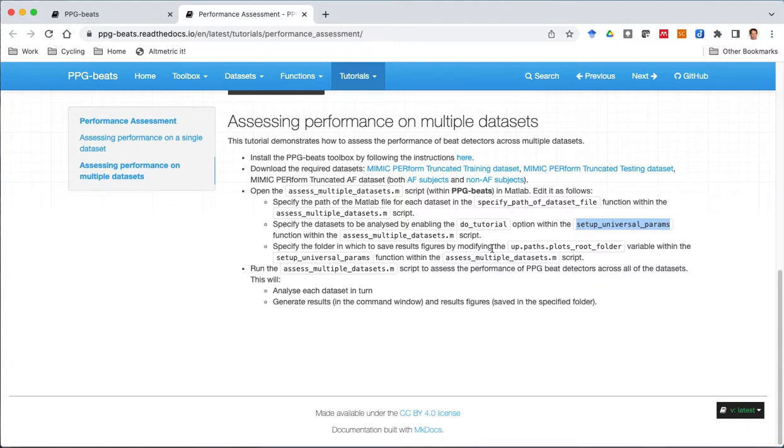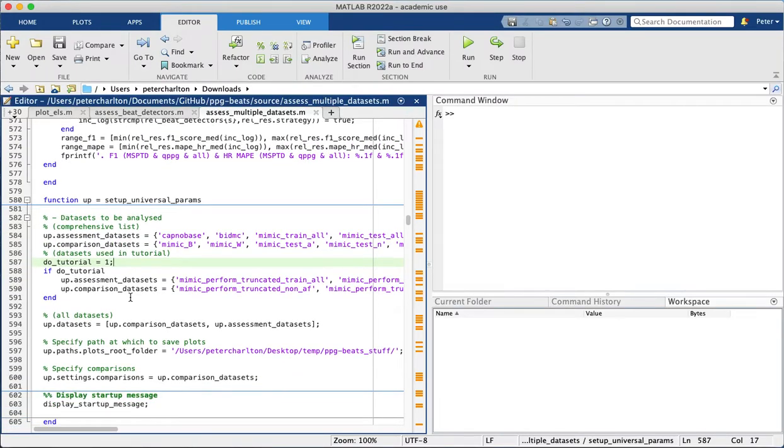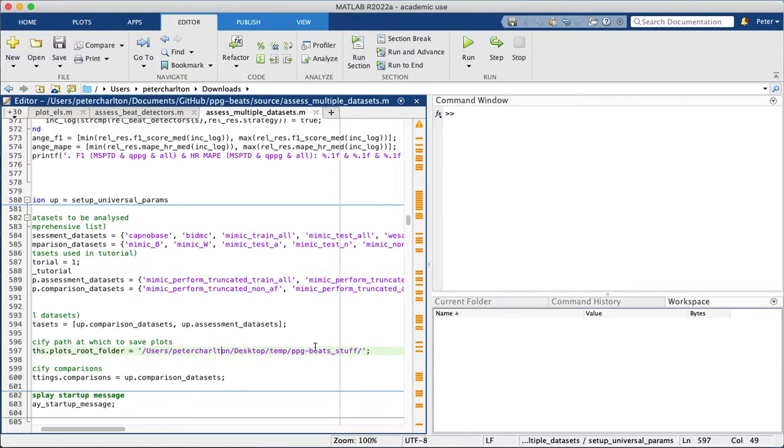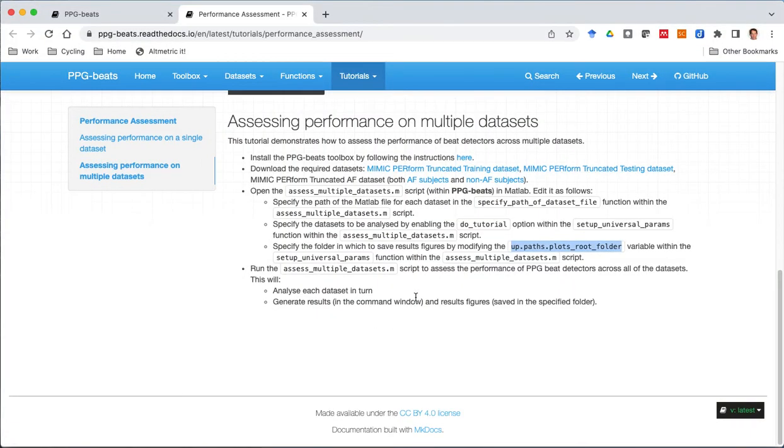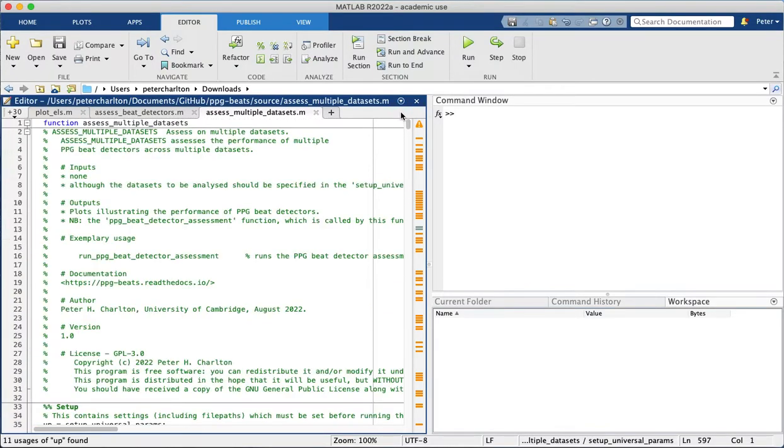And then the third step is to tell the script where to save the results figures in this folder here, which again is still in the same setup universal params function. So that's this line here, and I've told it to save the results in this ppg beat stuff folder, and you will want to replace that with your own folder. So we're now ready to run the script to assess the performance of ppg beat detectors across all of the datasets.